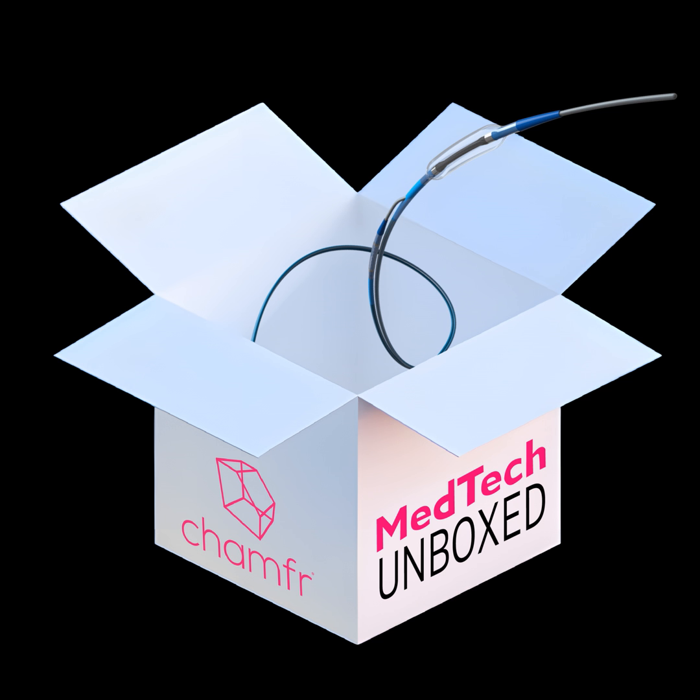Chamfr came in handy as always, right? Absolutely. Good. Yeah, that's a good tool to use. I mean, most of the low friction compounds from those extruded tubing are all on Chamfr. Propel, the Dynaflex has their Everglide, and then there's others as well. Okay, great. So there are plenty of options for liners. Yeah, as long as you have the basic mechanical properties, you can put them in the software and it will simulate them for you. Okay.